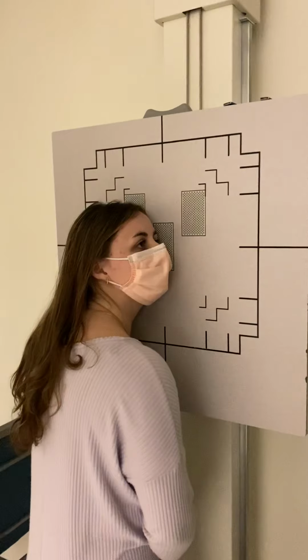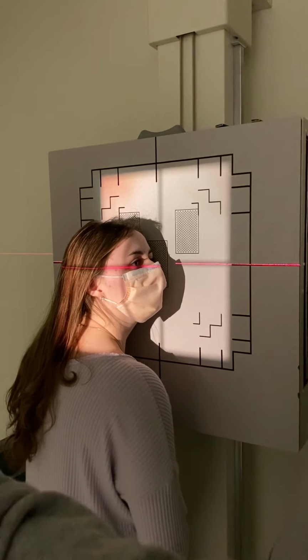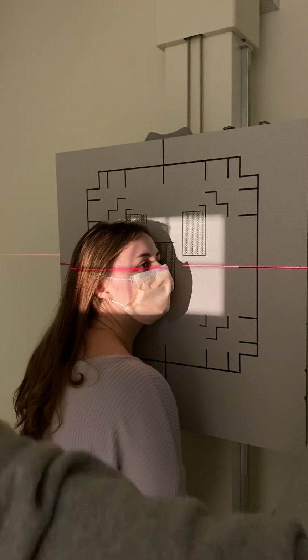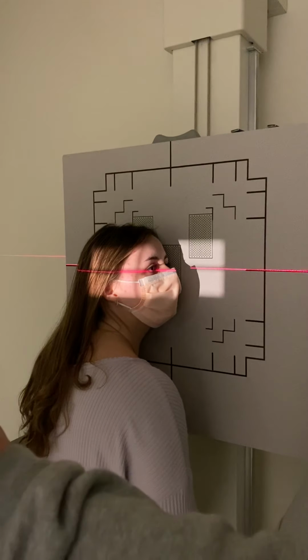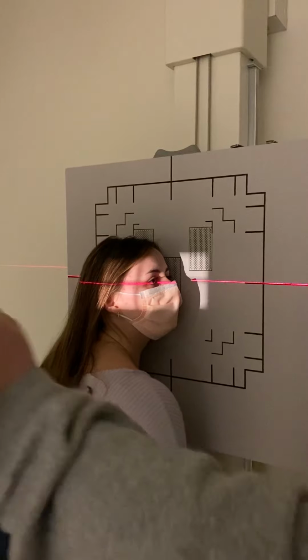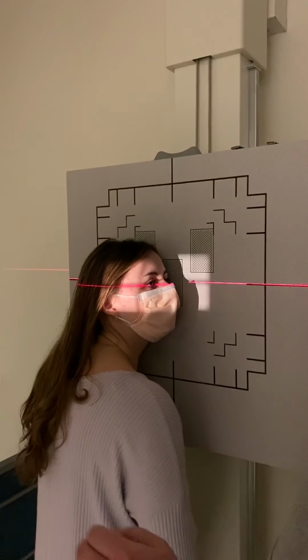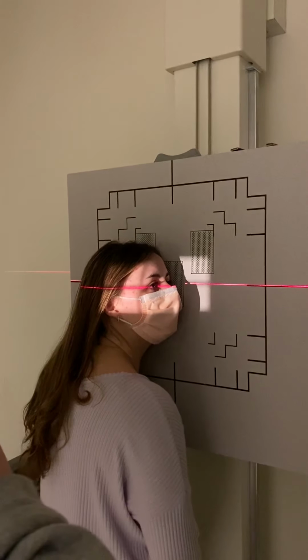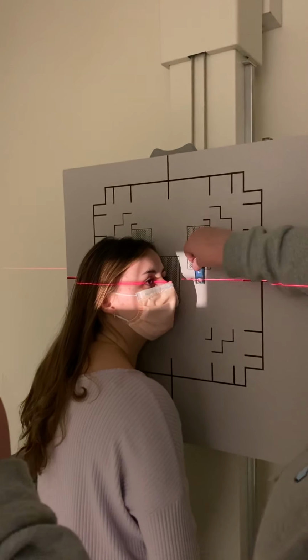Line up my Bucky. And then we're going to collimate down to the supraorbital margin and the infraorbital margin. I'm going to tell her to look ahead and keep her eyes as still as possible. So find a point on the wall and stare at it. And I'm going to mark the side down.